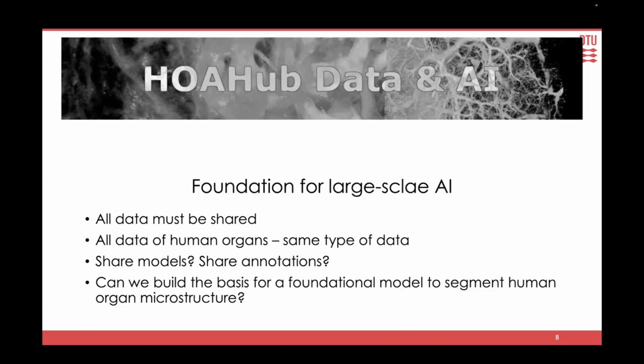So what about working towards sharing not only the data, but also the models that have been used to segment and analyze the structures, and especially sharing annotations, because deep learning-based segmentation requires annotations.